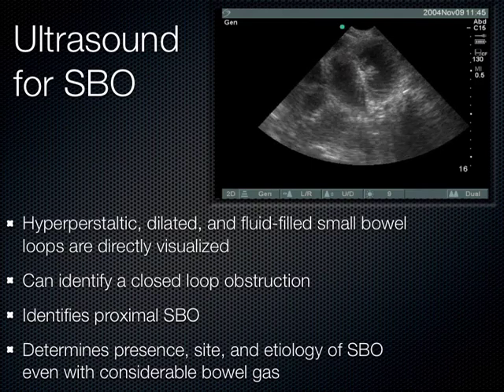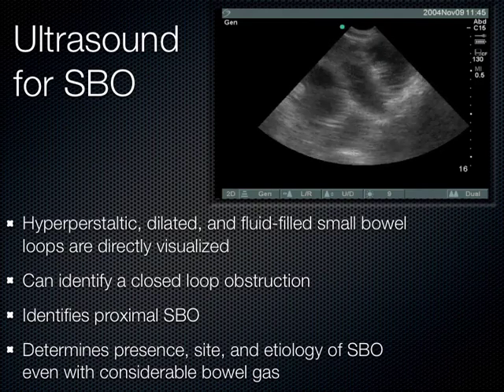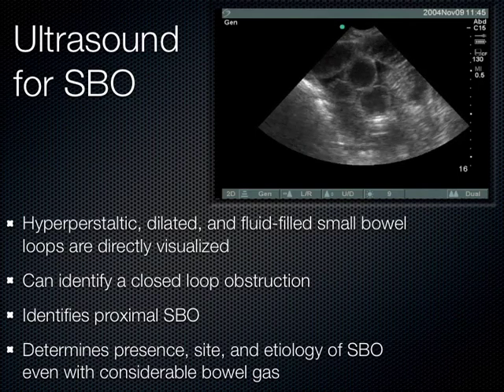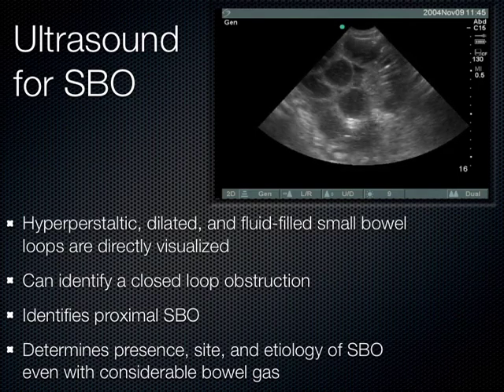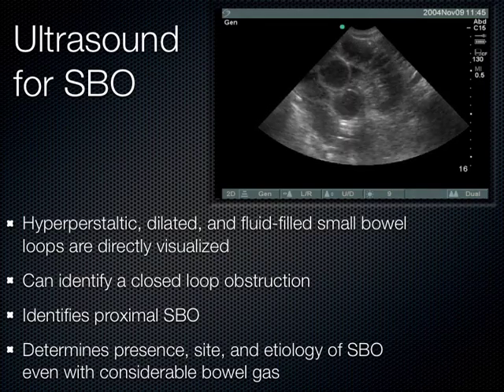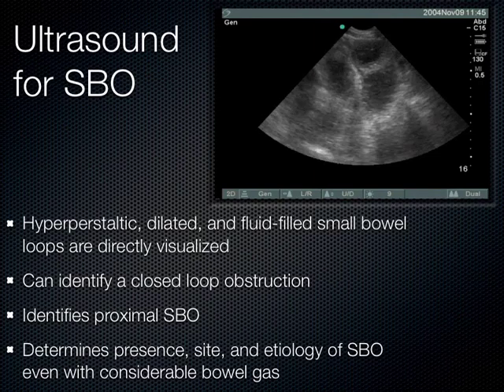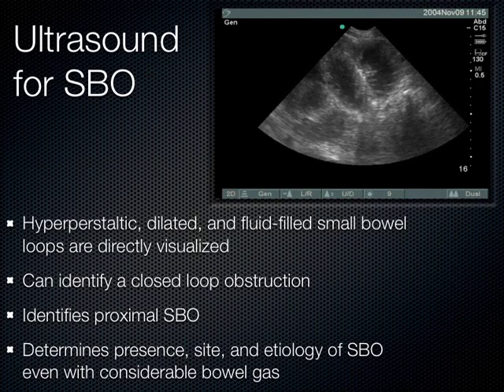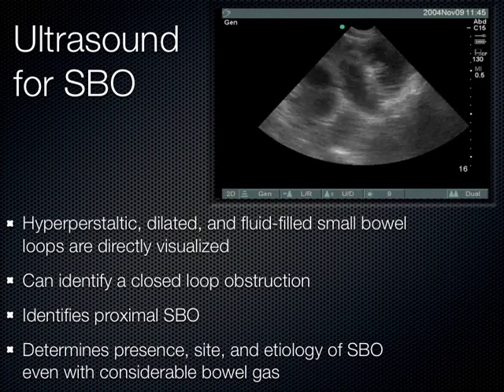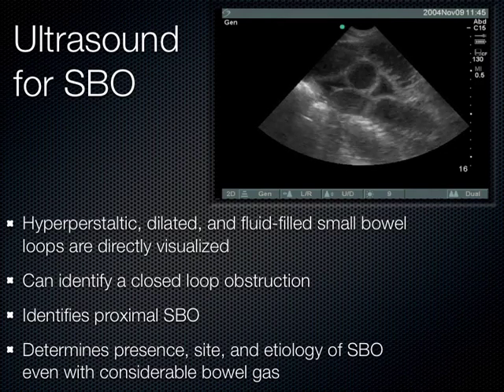And what you see with ultrasound is pretty easy to see, actually. If I've got a patient who's pretty distended, I just walk over with the ultrasound probe, they're vomiting, they've got all the clinical signs of small bowel obstruction. Well, this is what I see. I see these dilated loops here of small bowel. Notice the plicae circularis going all the way across the bowel there. The walls are usually thickened, though sometimes in an early small bowel obstruction, the walls have yet to become thickened.